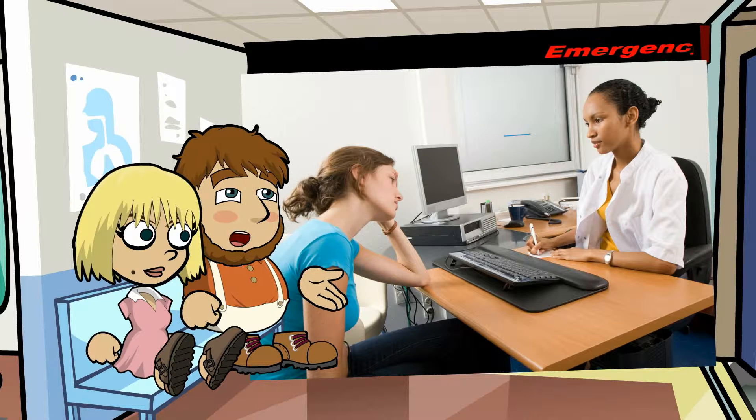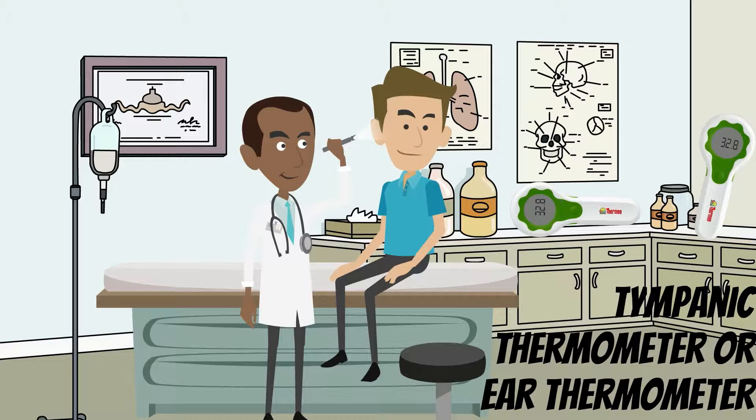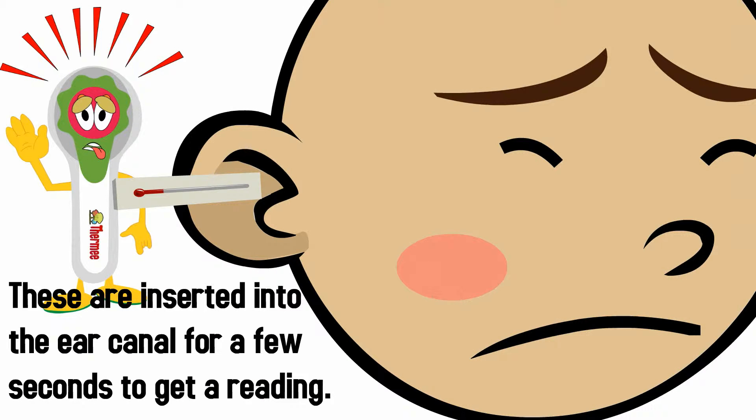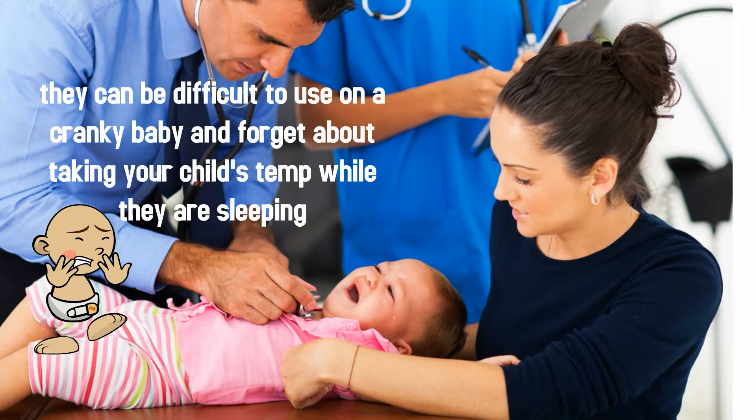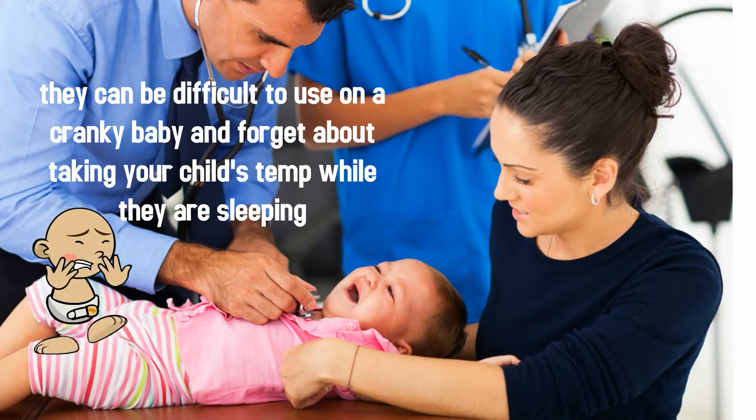If you were to visit an emergency room today, you will most likely have your temperature taken by a tympanic thermometer. These are inserted into the ear canal for a few seconds to get a reading. They can be difficult to use on a cranky baby, and forget about taking your child's temp while they are sleeping.